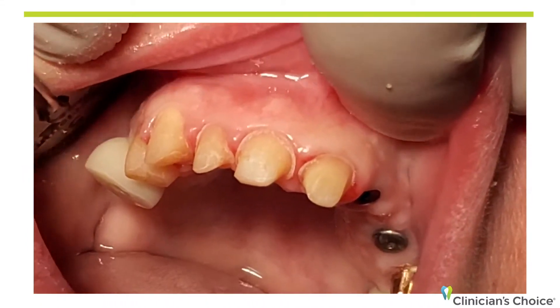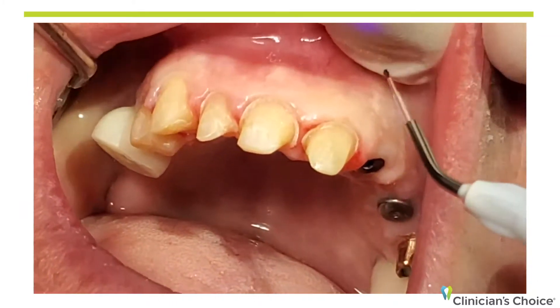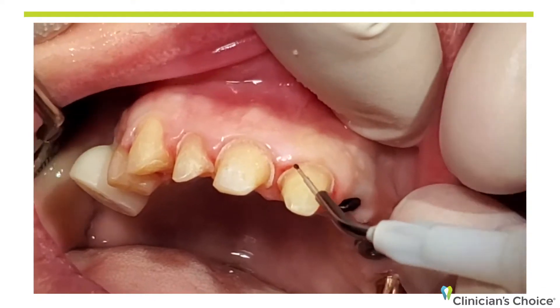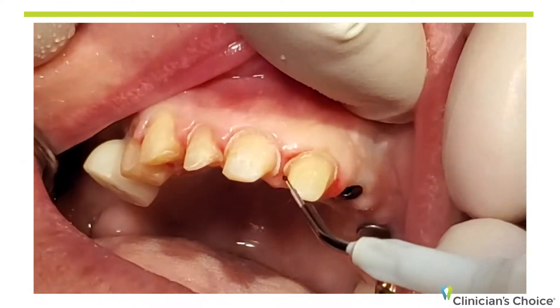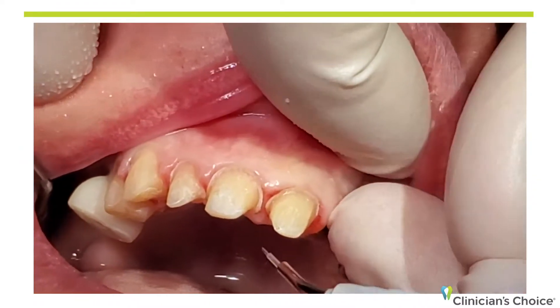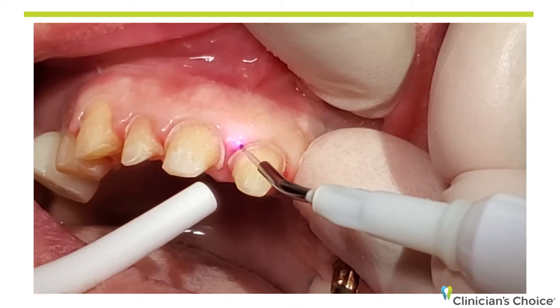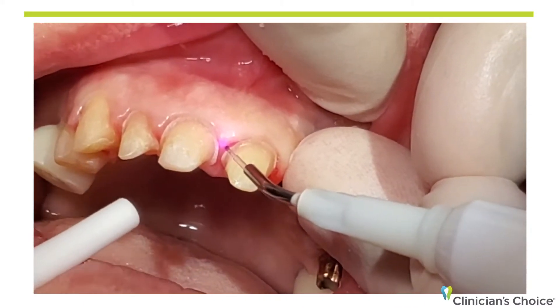One clinical tip when using a diode: even though this tip is ready to cut, if I hover over the soft tissue just for a few seconds first, I'll be able to cut even more readily. The diode needs to be in contact to cut. When I start right here, I'm going to step on the pedal and hover over the soft tissue for a few seconds. This is six tenths of a watt — minimal energy.